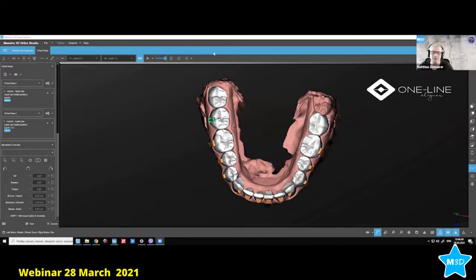Yes. Okay. I think this is a good thing if printing comes in. Yes, but at the moment I think the materials are a little bit tricky to print the aligners. But this is something that will come in the next year, roundabout. We are going to print. We just got a new printer with the clear aligner. I'll just show you. We just received it last week.